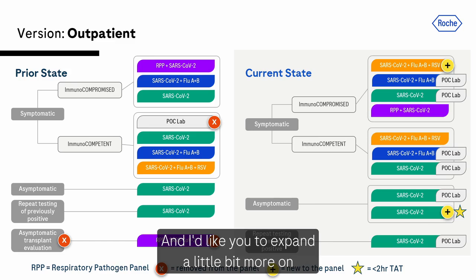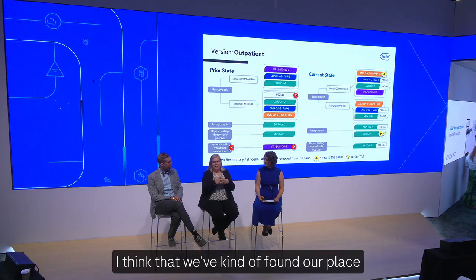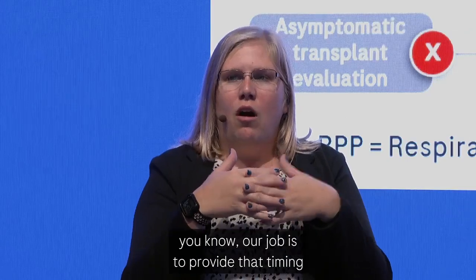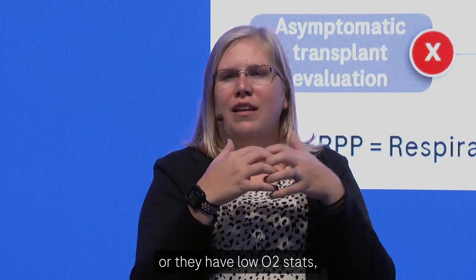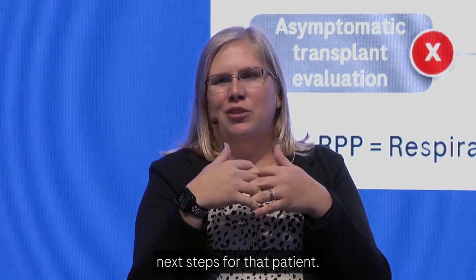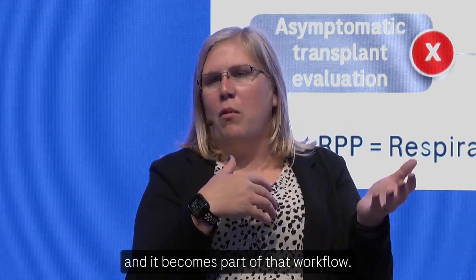And I'd like you to expand a little bit more on how this impacted MIDL, but from a point of care perspective, I think that we've found our place and we're level set. Our job is to provide that timing for those patients that are really going to maybe be admitted or have low O2 sats and the provider is really concerned about next steps for that patient. And if it's self-limiting or they can wait for a result, they're just going to send that to main campus and it becomes part of that workflow.